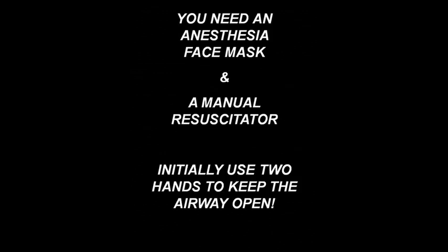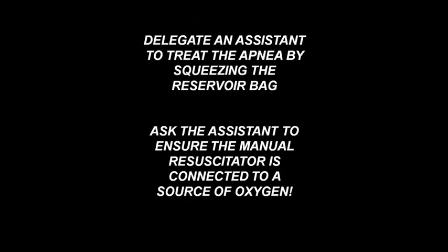For novices in this situation, you'll proceed as follows. You will need an anesthesia face mask and a manual resuscitator. So initially, you will use both hands to keep the airway open. You may need to insert an oral airway. Once you have the airway open, you delegate an assistant to treat the apnea by squeezing the reservoir bag, but ask the assistant to ensure that the manual resuscitator is connected to a source of oxygen.